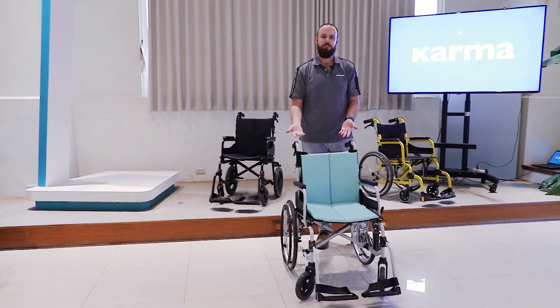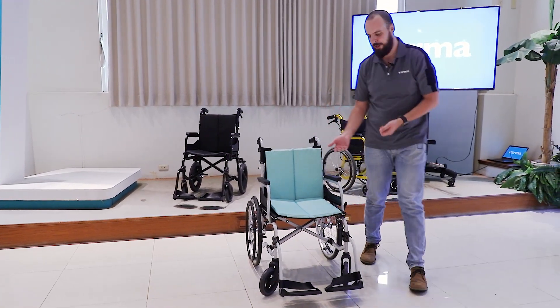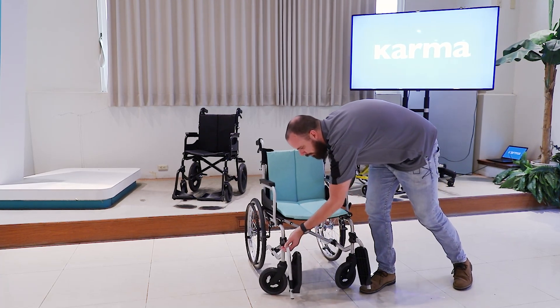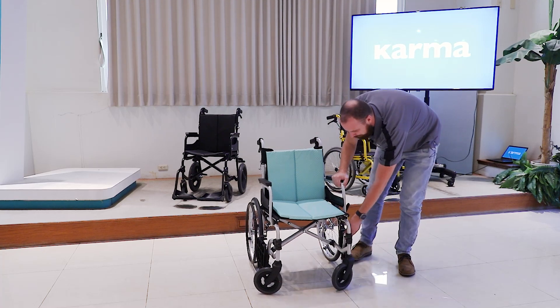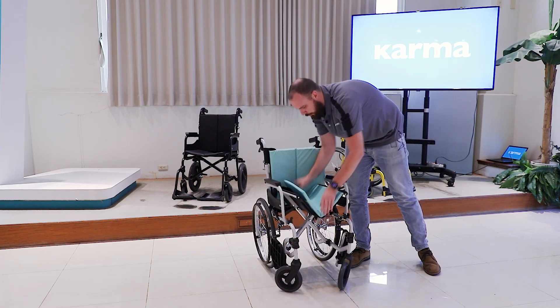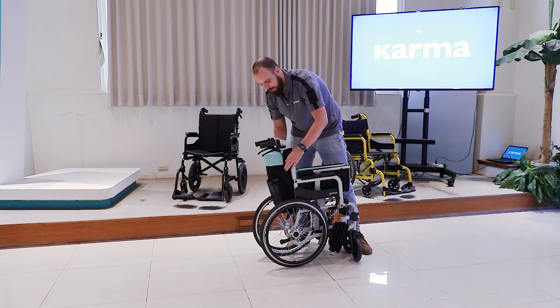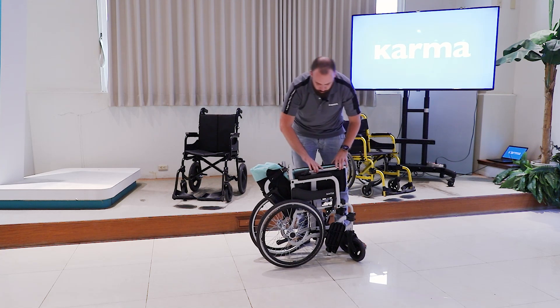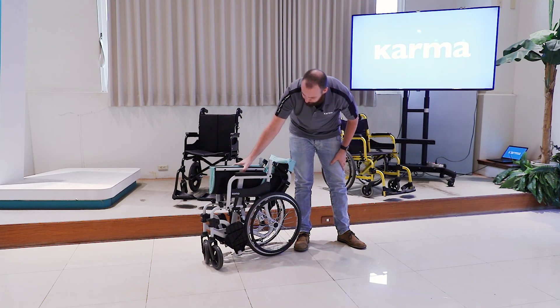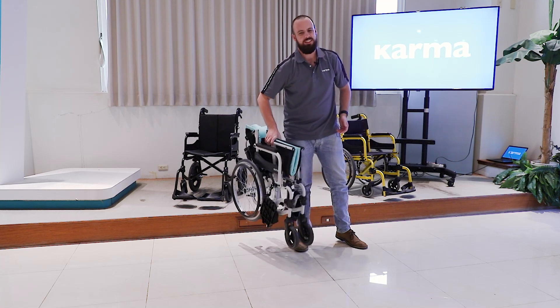Let me give you a quick demonstration of how easily this folds up. Just flip up the flip plates, lift and turn, lift and turn — one hand in front, one in back — lift and push. Then use the standard fold-down backrest by pushing down the two clips. This results in a really compact size for a standard manual wheelchair.